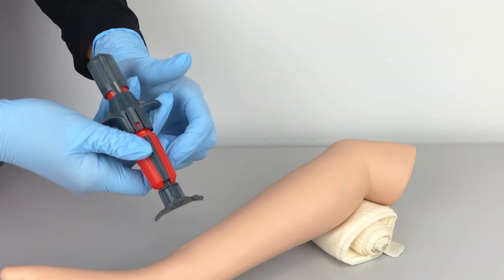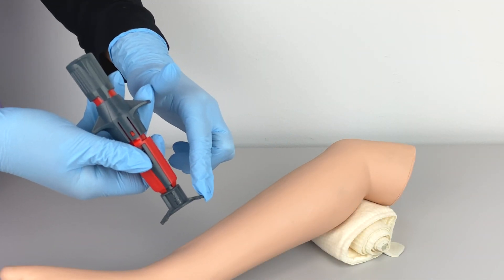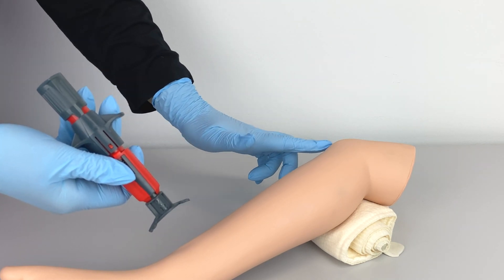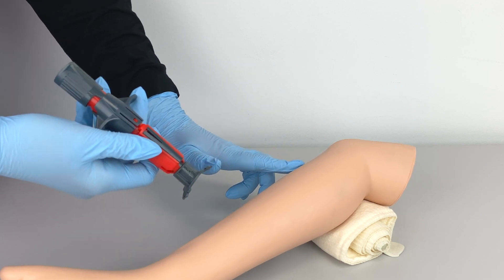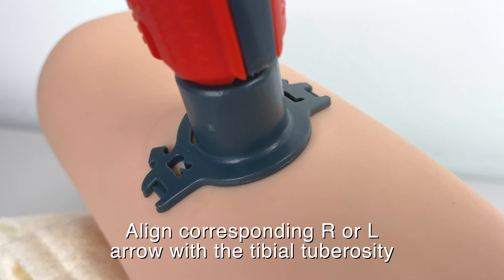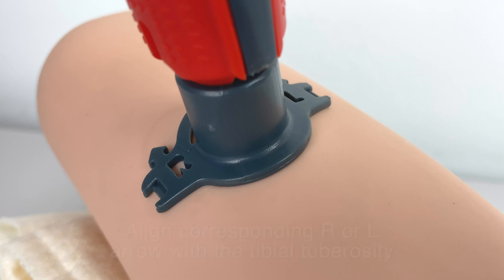Place the designated location arrow — right for the patient's right leg, left for the patient's left leg — on the prominent aspect of the tibial tuberosity, with the location arrows pointing upwards towards the knee and parallel to the long axis of the tibia. This aligns the device so the insertion site is medial to the tibial tuberosity.